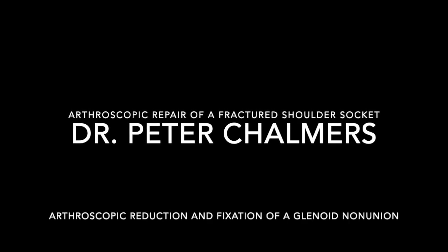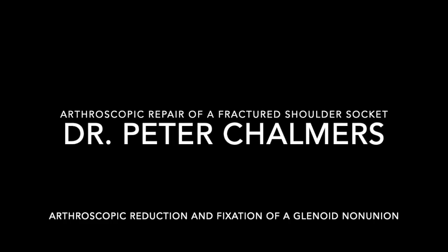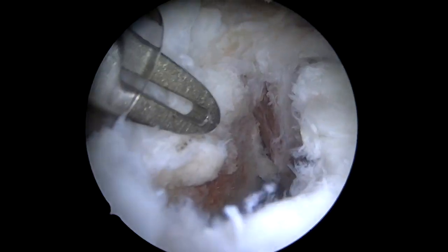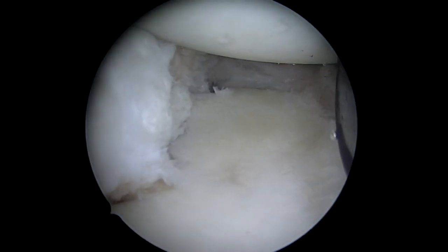Welcome to this video on arthroscopic repair of a fractured glenoid — specifically a non-union treated with arthroscopic reduction and internal fixation with a screw. You can see the non-united fragment and where it's supposed to go on the glenoid. What we'd like to do is get that reduced and fixated.